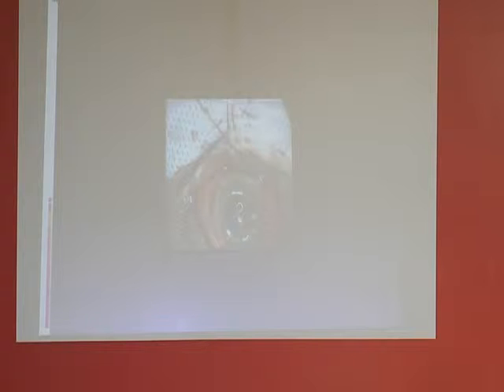So in these cases, if you want to plan surgery, the first step is to form the globe. Unless you form the globe, if you want to go inside and put in a cannula, you're going to damage the lens. In most trauma cases, the retina is incarcerated anteriorly. So most of the time, if you want to go for a primary surgery in a hypotony eye, you can go in with a 30 gauge cannula and form the AC very nicely. When the AC is formed nicely, as you can see here, we can go ahead with subsequent surgeries.